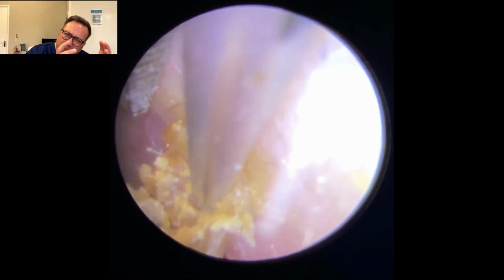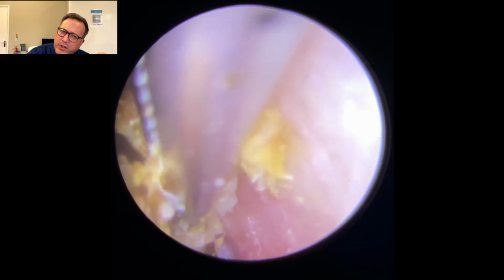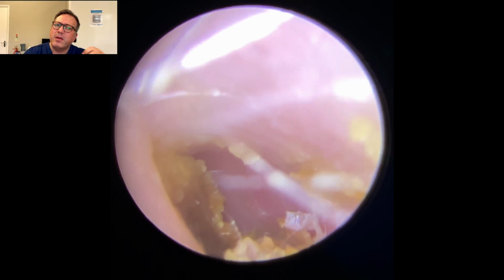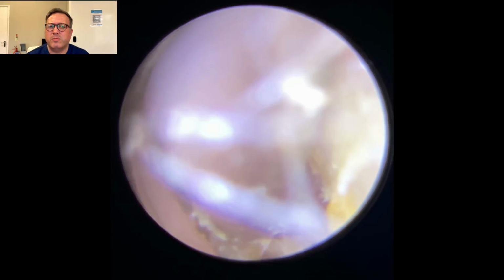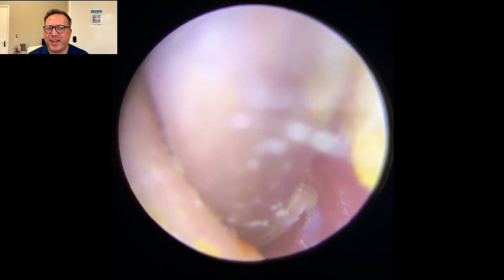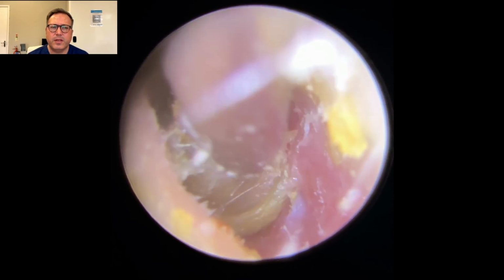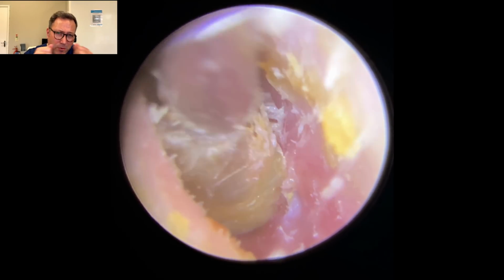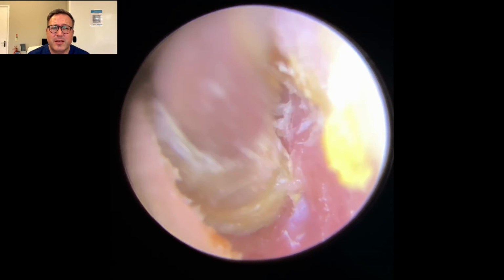But it's kind of this in-between state. It's not really solid enough to get a good grip to hold the whole thing to bring it out. It's actually just the jaws pinching straight through it, just breaking it away. But then it's not soft enough to be able to pull out in one kind of blob as well, if you like. So it's kind of a difficult texture of wax to work with, this type of wax. And just lifting ever so slowly, giving it a bit of a wiggle back and forth just to try and kind of loosen it from all sides.